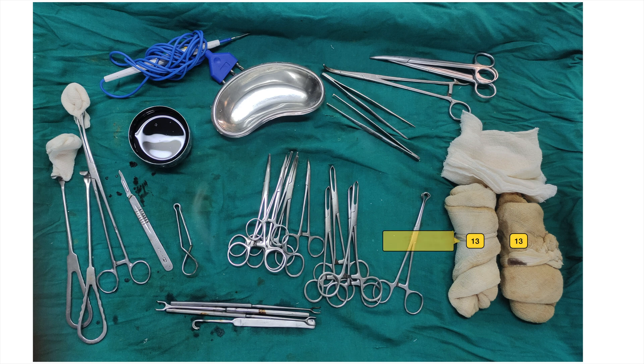13. Surgical mop. 14. Babcock tissue forceps. 15. Alice tissue forceps. 16. Artery forceps, plain and curved. 17. Double hook thyroid retractor.